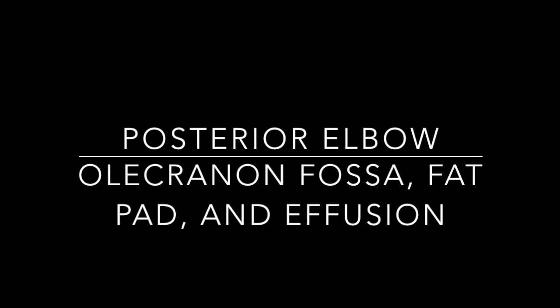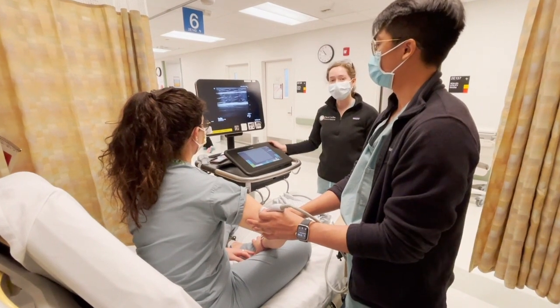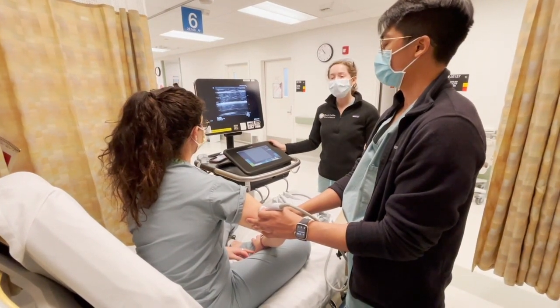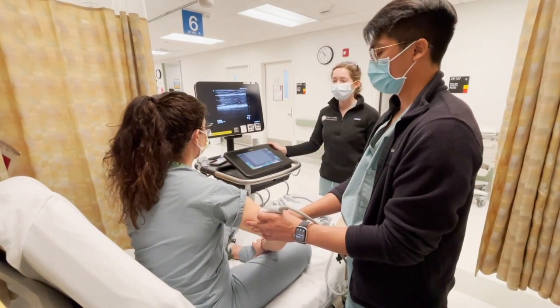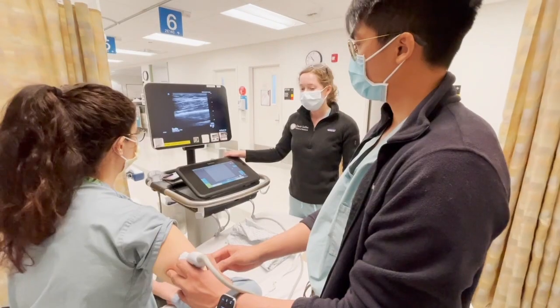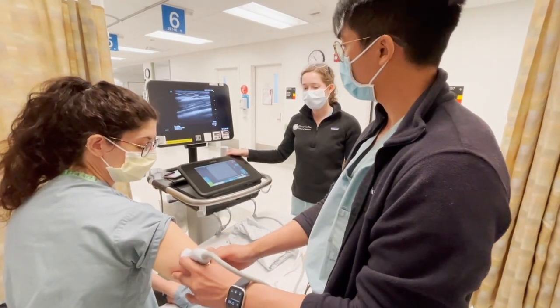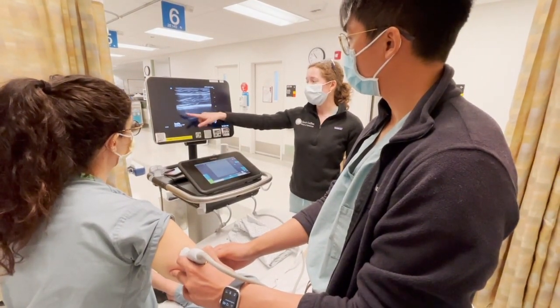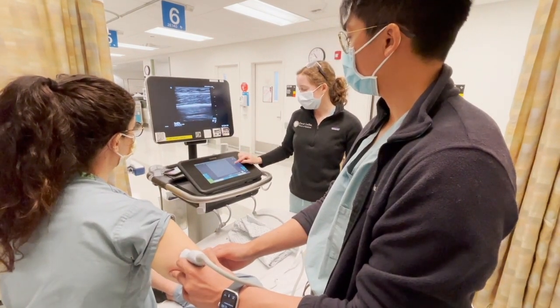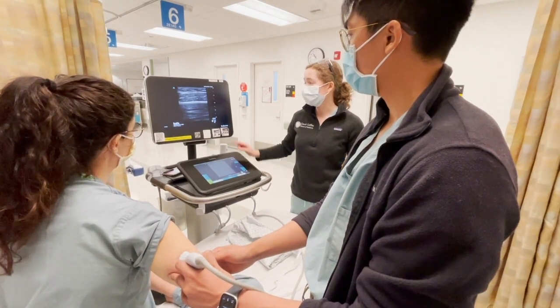We have a patient who presented after falling on her right arm with elbow pain. X-rays didn't show any obvious fracture, but we want to look with ultrasound because we're still concerned about a possible occult fracture. We're going to start by putting the probe on the posterior upper arm so we can get a view of the triceps muscles and the humerus.